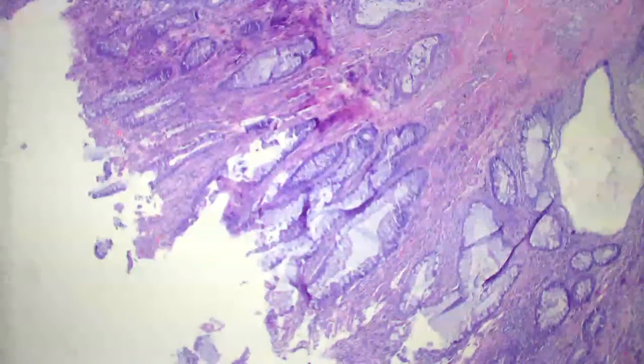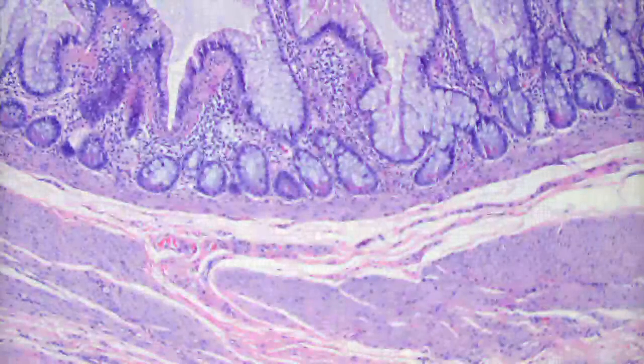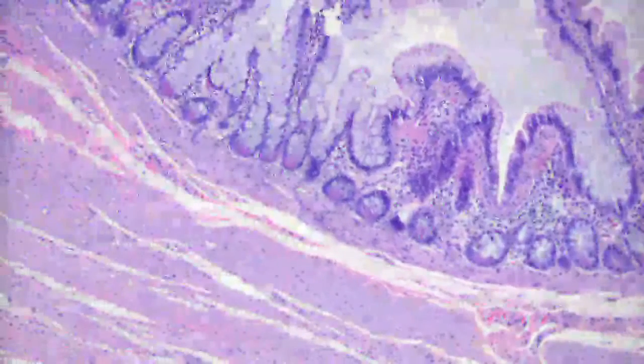Cutaneous Crohn's, something else I was thinking of. What's the histologic pattern of cutaneous Crohn's disease? It didn't look like this, and I was looking it up. If you do a biopsy of somebody's GI tract with Crohn's, what do you see there? Flattening of the villi and granulomatous inflammation. Yeah, it's like a sarcoidal granulomatous inflammation.